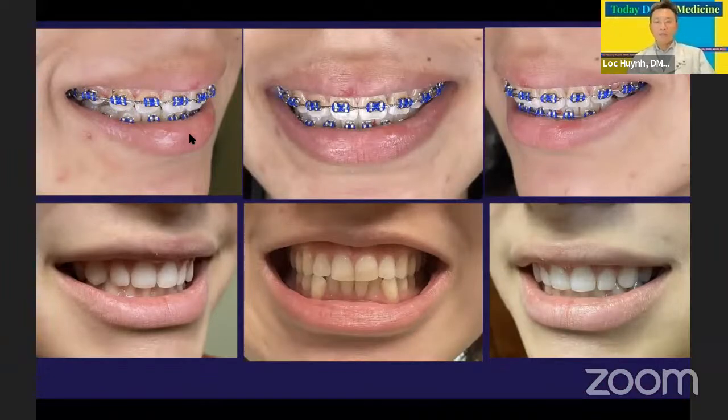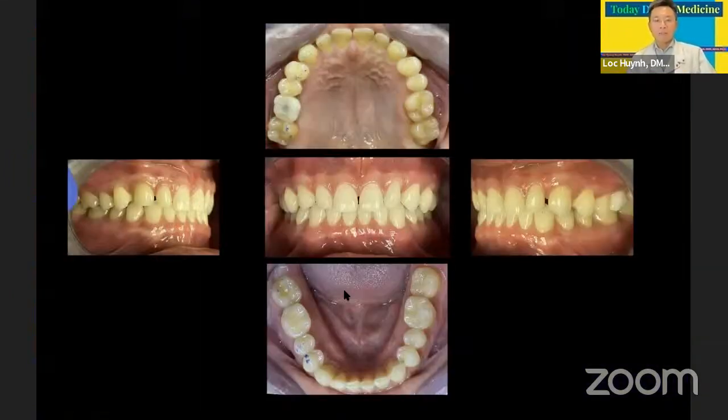Another photo using the Photodontist device attached to the cell phone. You can see the quality is improved right away when there's enough light. On the bottom here, there's not enough light, as you can see, it looks really dark.